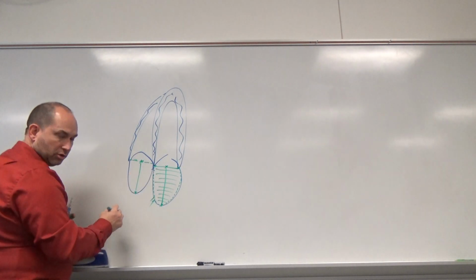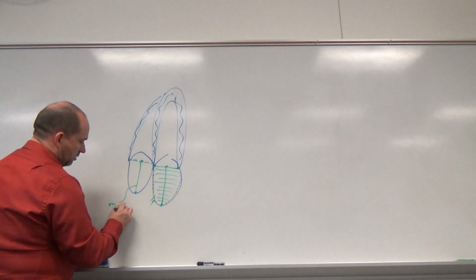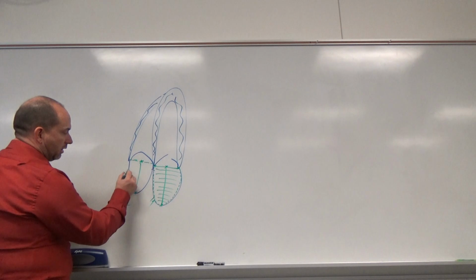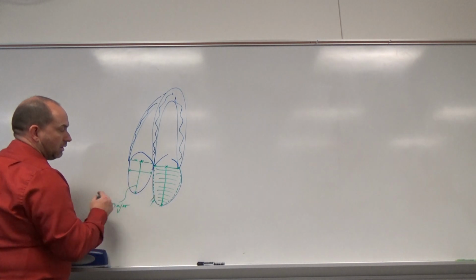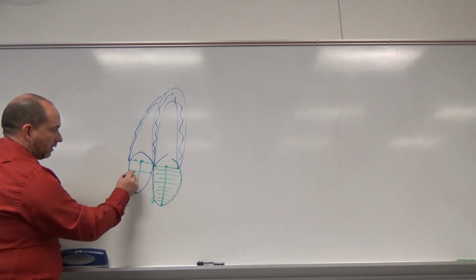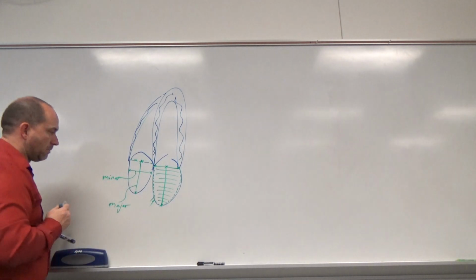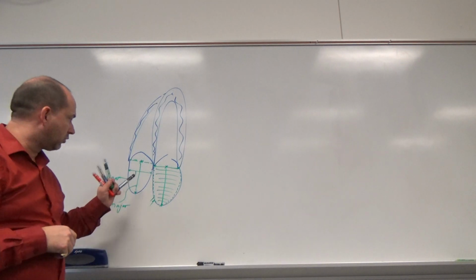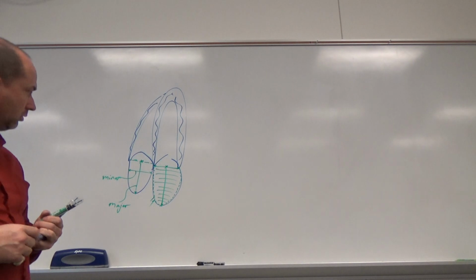That's my major. Then I'm going to take the maximum distance across where it's most dilated, 90 degrees to that, and that is my minor axis. So we'll do those 2 measurements, and then we'll measure it again from 2-chamber view.